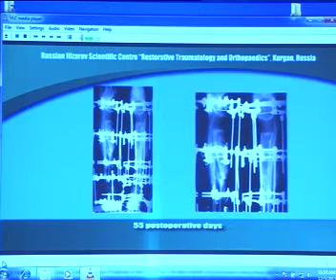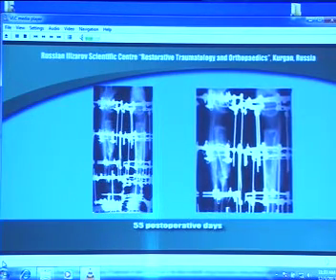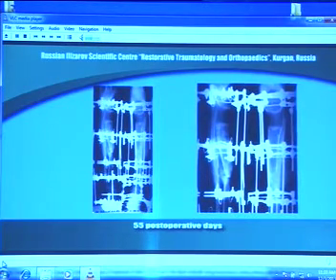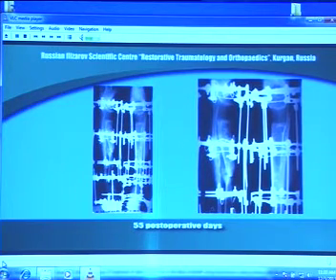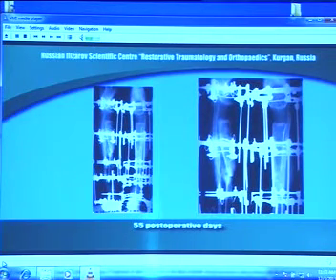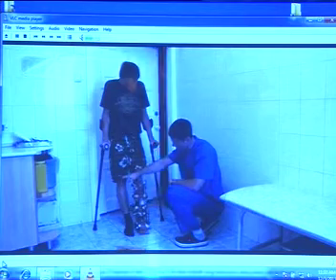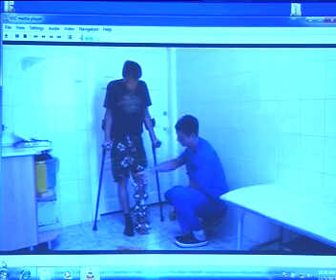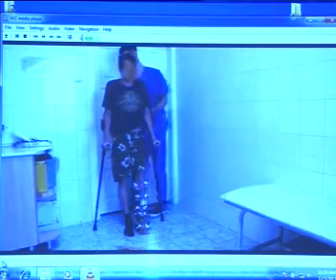Radiographs show the limb corrected with satisfactory bone fragment contact. The foot deformity is eliminated and a diastasis of 5 cm is filled with regenerate bone of moderate optical density in the proximal tibia. On discharge, the patient could walk with crutches, maintaining partial weight bearing on the left lower limb. Limb length discrepancy is eliminated and the foot deformity corrected.